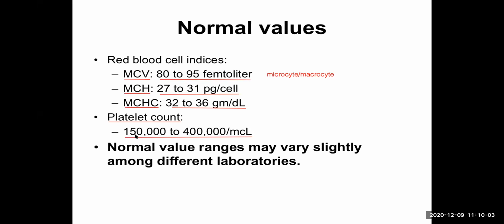What is the term we use if the platelet count is lesser than the normal? Yes, thrombocytopenia. Very good. Thrombocytopenia is lesser than 150,000. But let me clarify once again, in clinical practice, we don't worry that much if it is between 100,000 to 150,000. When it is dropping lesser than 100,000 or 1 lakh, then I am a little bit concerned.